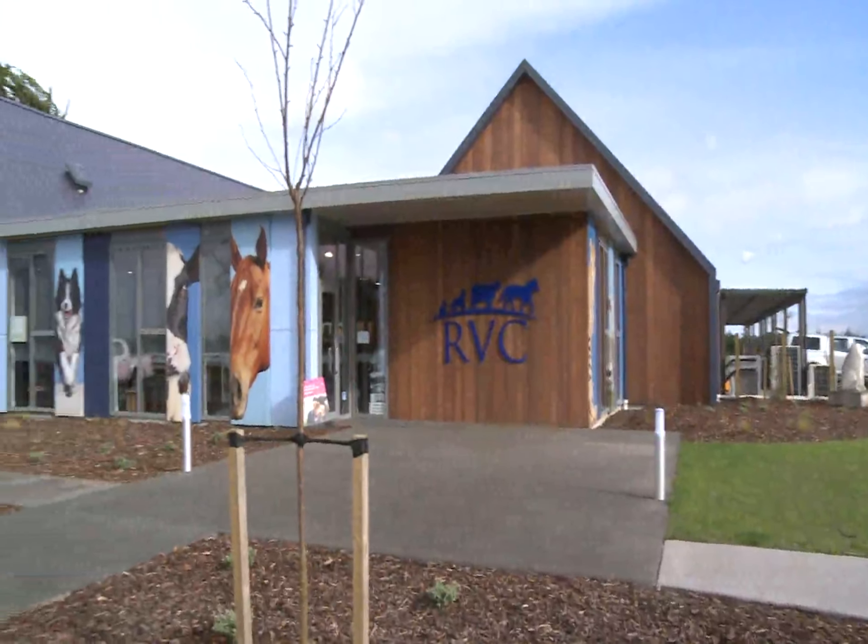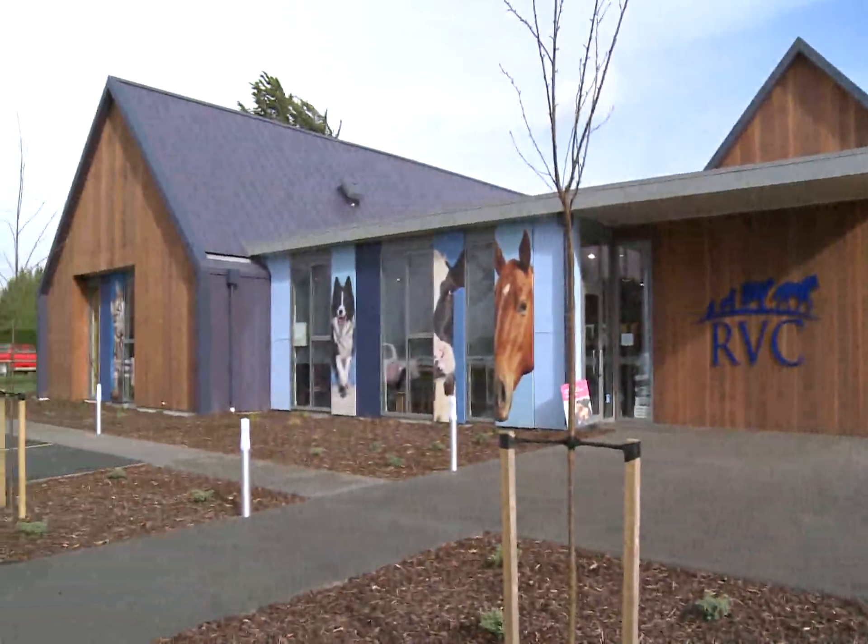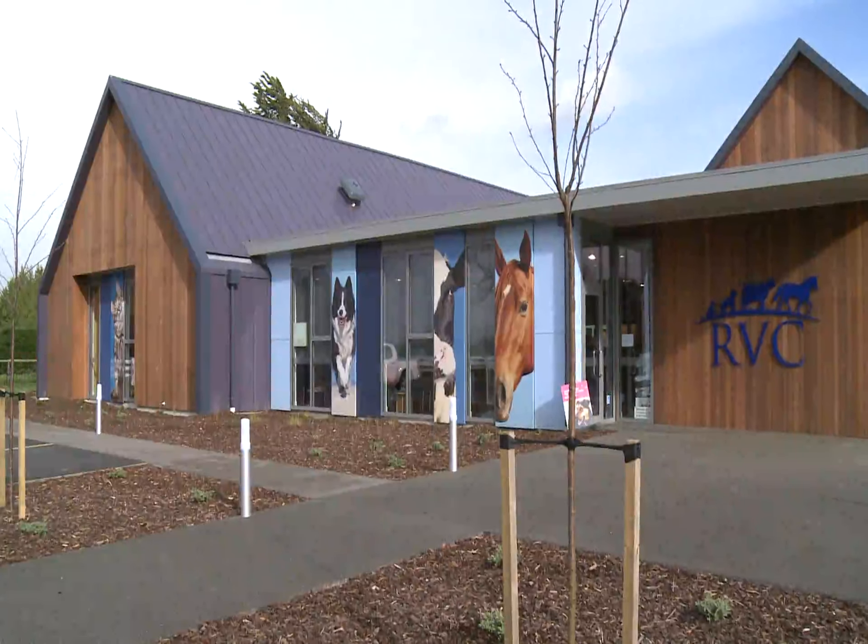Today at the Rangiura Vet Centre, Max is in to be neutered. Sophie talks us through the process.